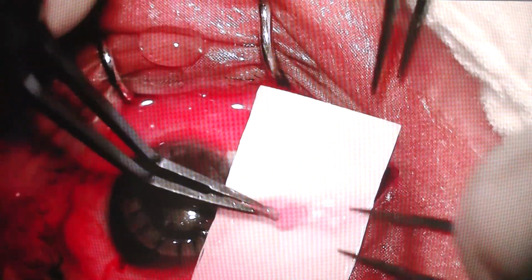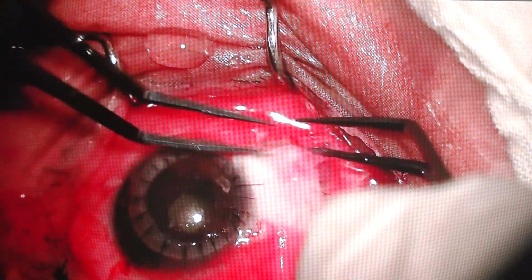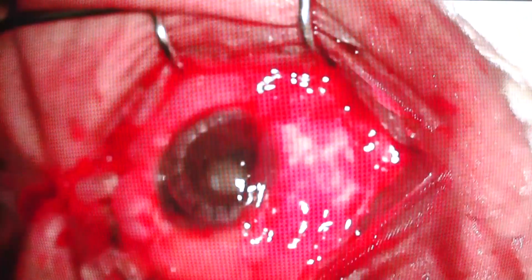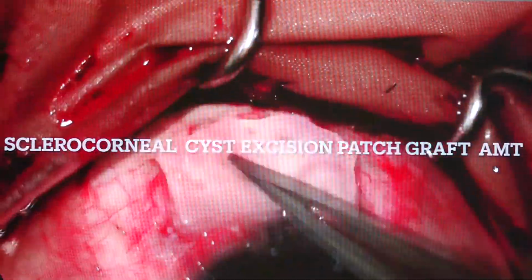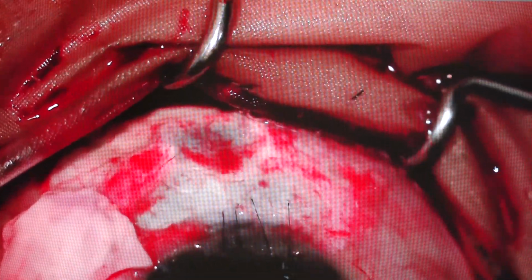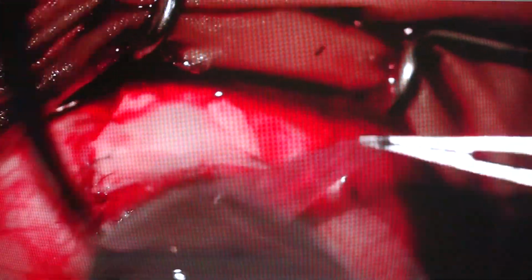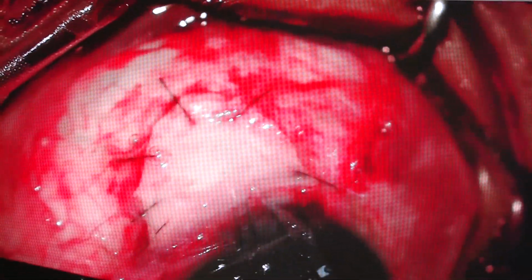So now we are using the freshly prepared human amniotic membrane and covering this area, and then a tarsorrhaphy would be performed over this area just to promote wound healing. I thank Dr. Nibedita Das, my colleague in the cornea department. Here there was a cyst in which she has done a scleral patch graft. She has used glue and interrupted sutures, and now she will be using a human amniotic membrane over the patch graft.